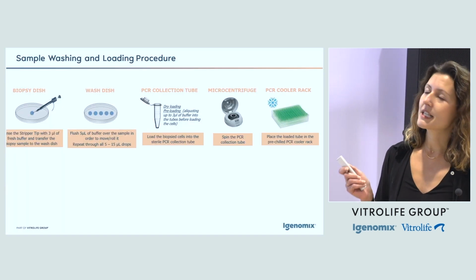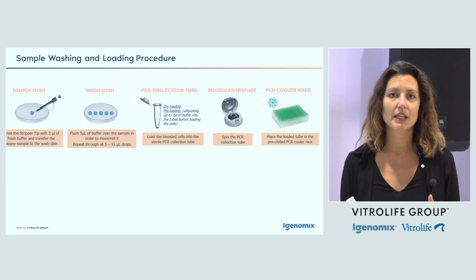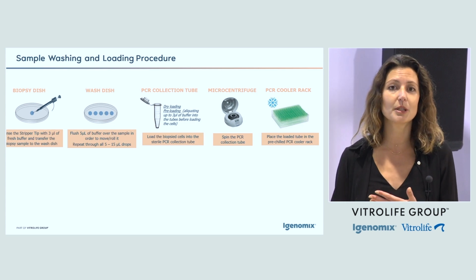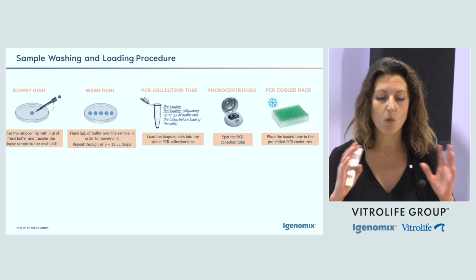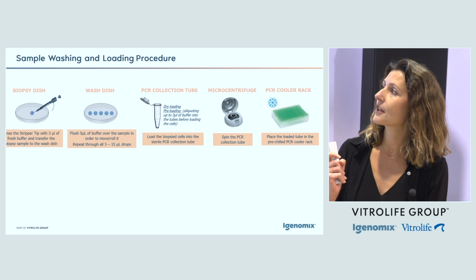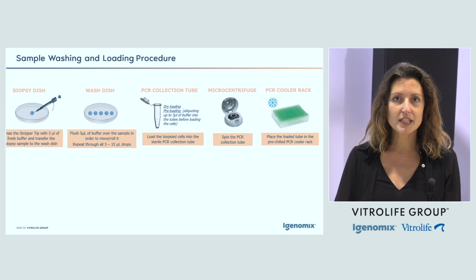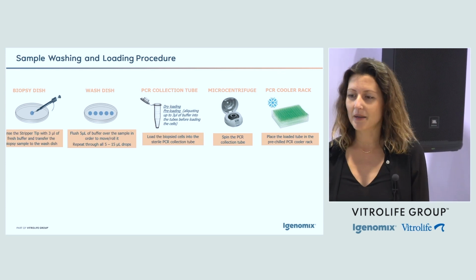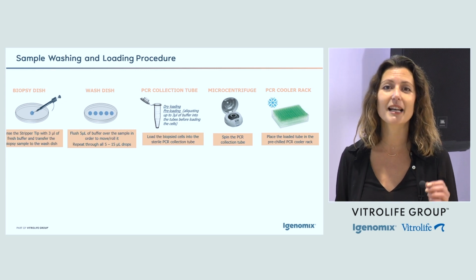So let's review this. This is our loading protocol. Most of the people that have been working in an IVF lab or in the clinic in general would think that this is the easiest protocol. And in some ways it probably is, because at the end of the day, once you have the biopsy, you're going to collect those biopsied cells, the trophectoderm cells, wash them in our buffer, put them in the tube, freeze it, and send it back to us. So it's supposed to be easy, but I'm going to use a sentence that I learned here in the US, which is the devil is in the detail.